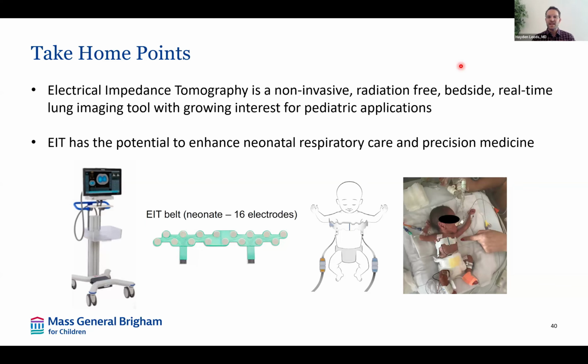The next person asked about, when doing PEEP titration, do you always do a recruitment maneuver before the decremental PEEP titration? I think that's a great question, and something that I have taught other people. We personally always do recruitment before for the effective tidal recruitment. I'm curious what you would do in your patients. Yeah, that's a great point, because that's how it's also reported in the adult literature.